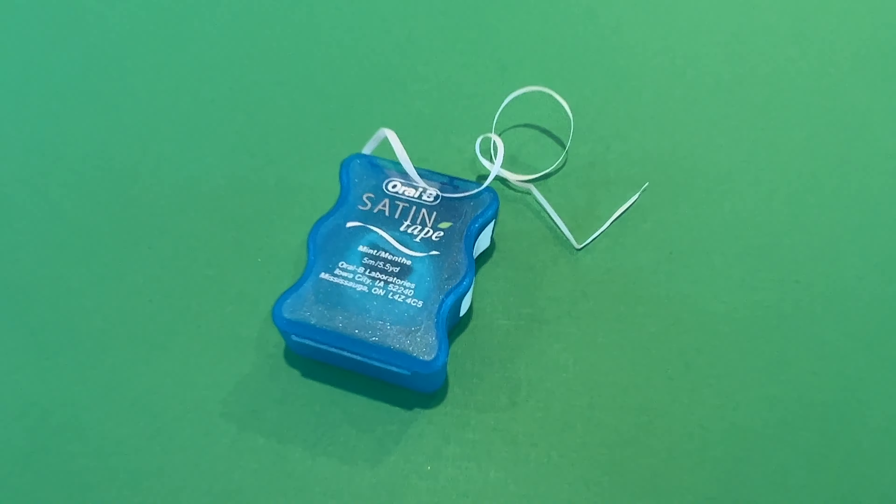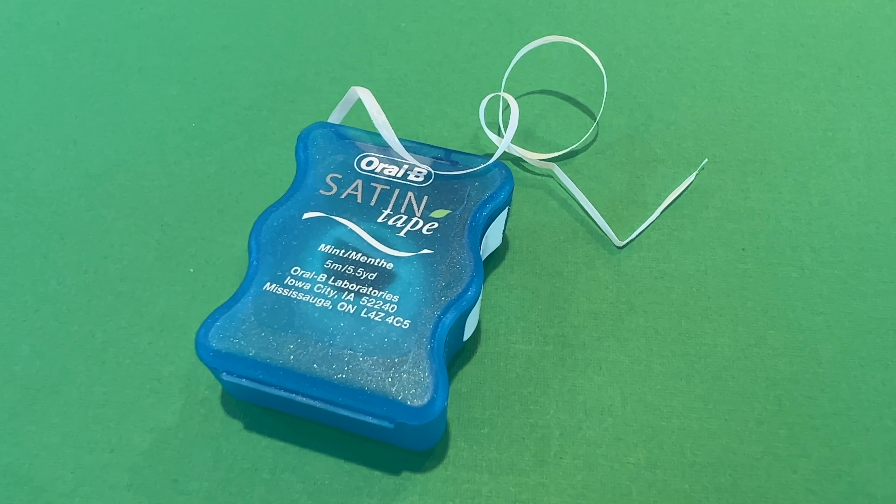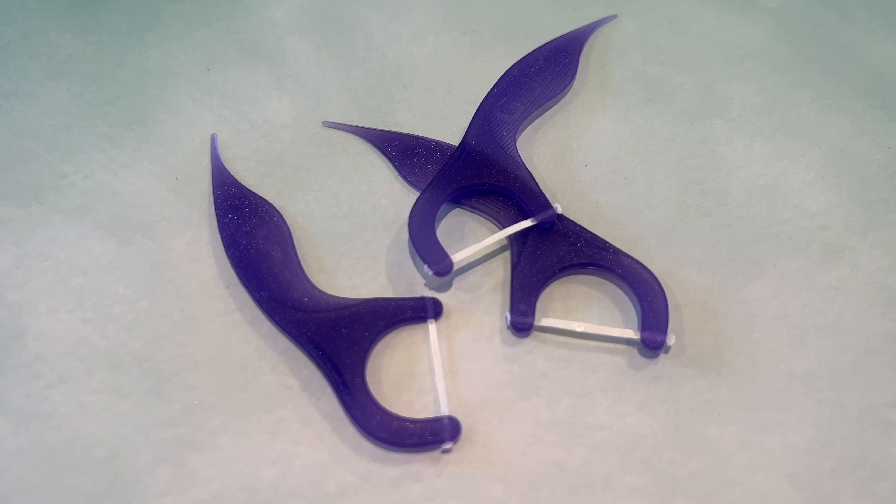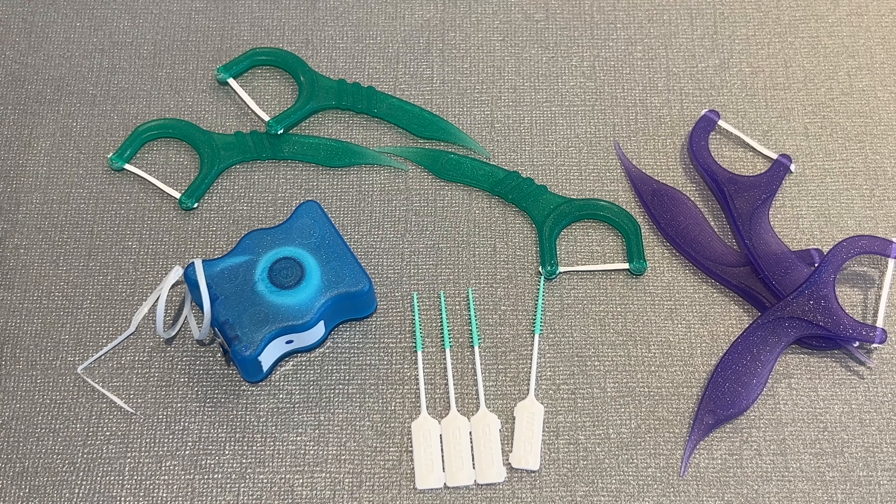Floss is a torture device. Sharp little ropes for your teeth with a minty sting. Or how about those scary looking picks or sticks? No wonder we all hate flossing.